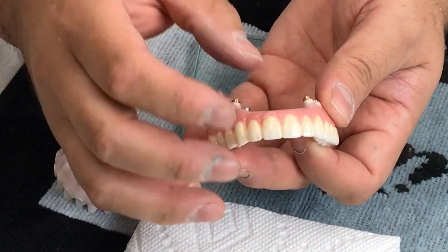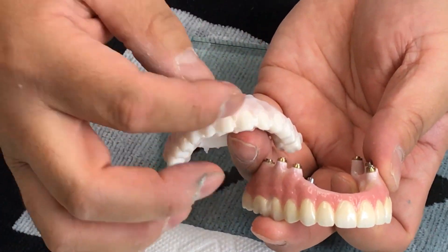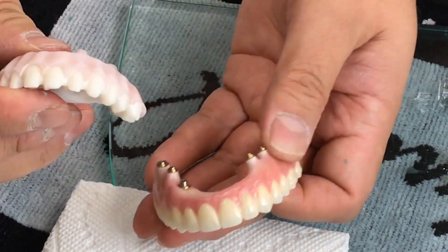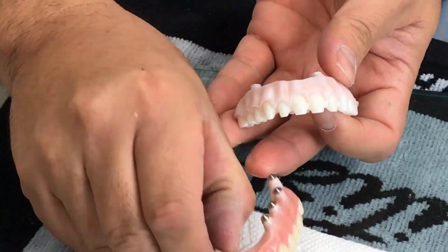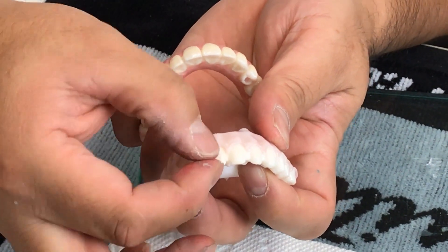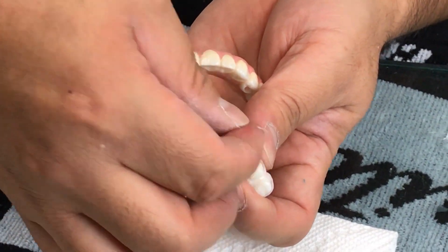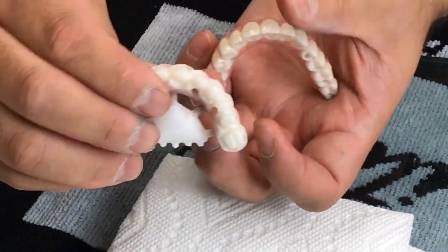Once you mill it out, you prep the tooth. You can prep the tooth on your software on screen, but the difference is — since we don't have a lot of space in the anterior region — we have to prep the tooth a little bit shorter than normal. I prep it short and put some grooves into the prep to make sure the crown will hold.